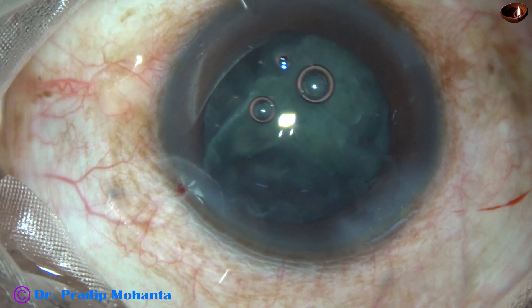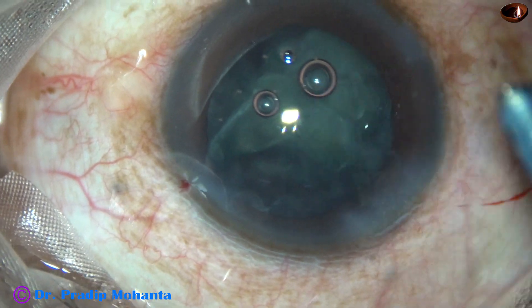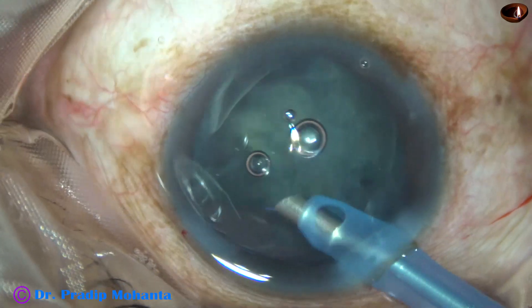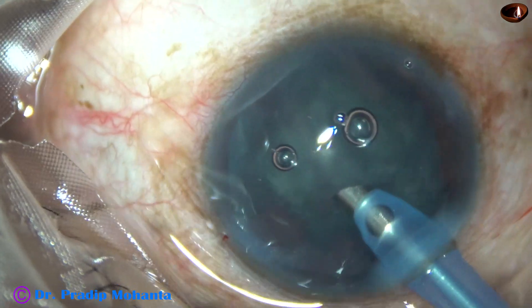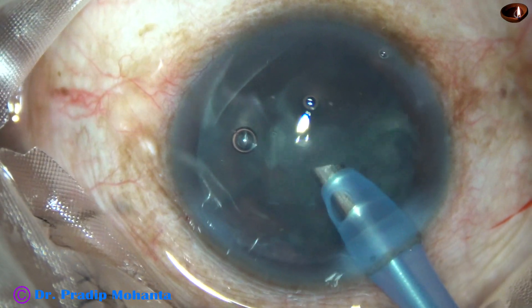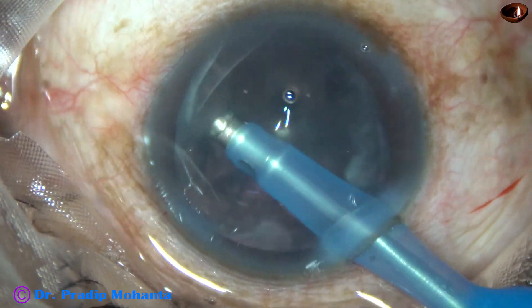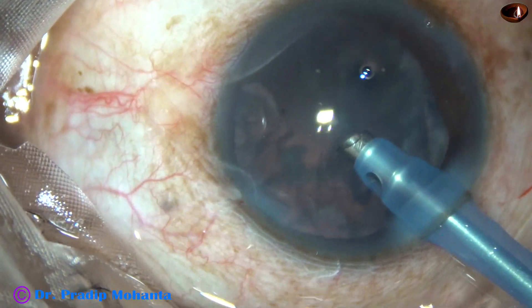A lot of lens matter is still there, so I inject viscoelastic, take the spatula, go through the right side port and pull the epinucleus towards the center — from 12 o'clock, pulling it toward center. I introduce the spatula behind the epinucleus and most of the epinucleus is now at the central part. The epinucleus-cortex complex is now out of the capsular bag. I find that the posterior capsule is intact.